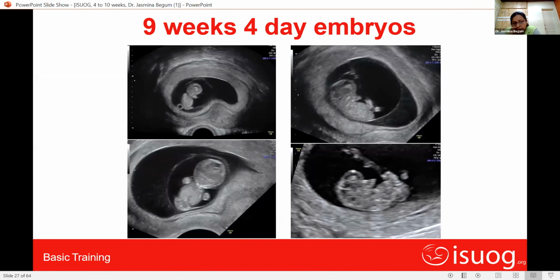So this is 9 weeks pregnancy. Date the pregnancy after 9 weeks by taking CRL. Measure the CRL precisely so that you can assign accurately the gestational age to the patient sonologically.